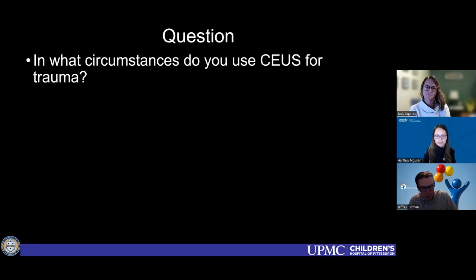So, in Colorado Springs, we only have one CT. So if our CT goes down, we don't have any other option to scan trauma patients. So we either have to go on divert or come up with some other mechanism of trying to scan these patients. I really tried to do it specifically in Colorado Springs, just to have an alternative for those cases when our CT goes down. But all those logistical hurdles are just too much for us to overcome, and the inconsistency of when we can offer this exam.